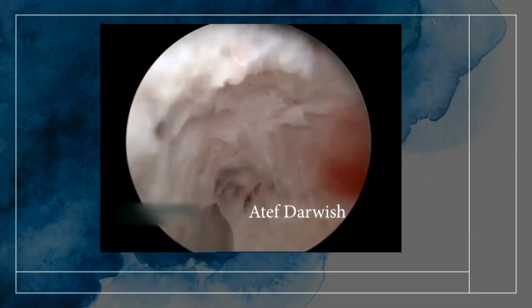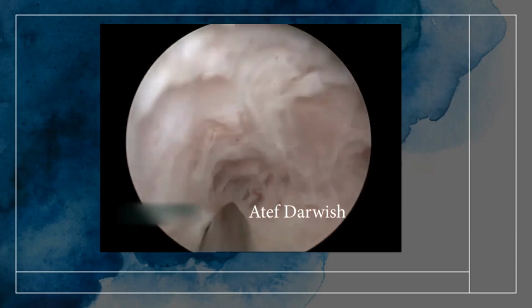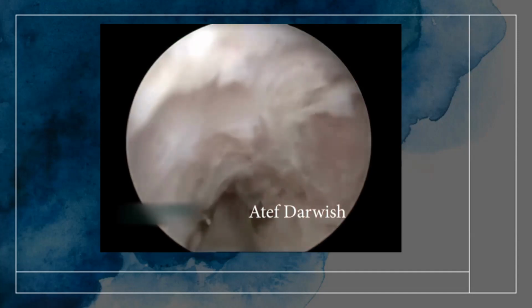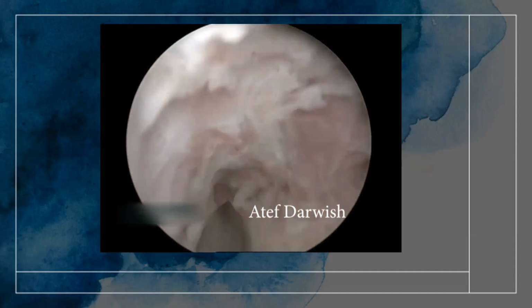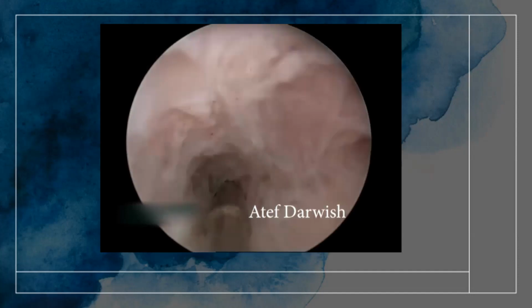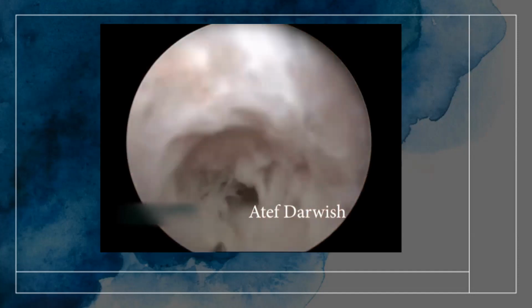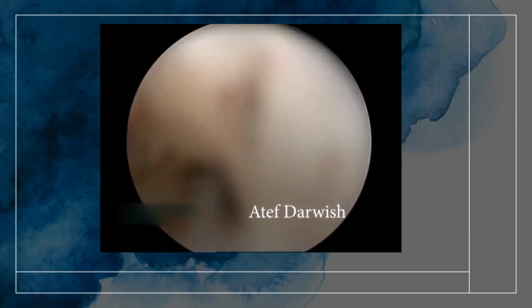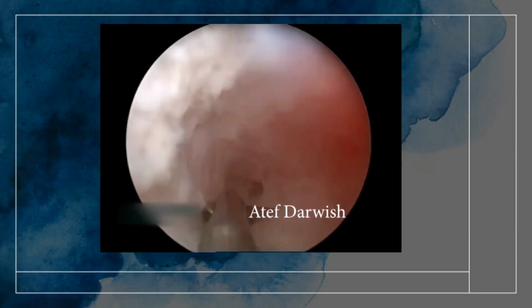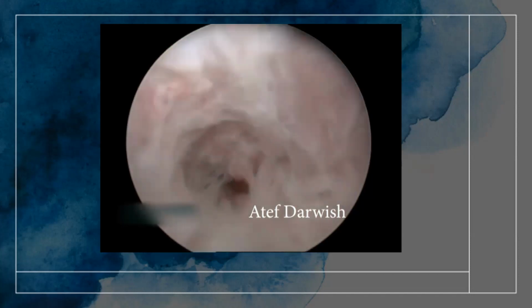They should be cut in a gentle way, also using the Hilton technique, because they are usually fine adhesions. Don't be aggressive, to avoid damage of the fallopian tube, because following the converging intramural part is the summit of the cone, which is the narrowest part of the fallopian tube. Any damage can lead to occlusion of the fallopian tube.